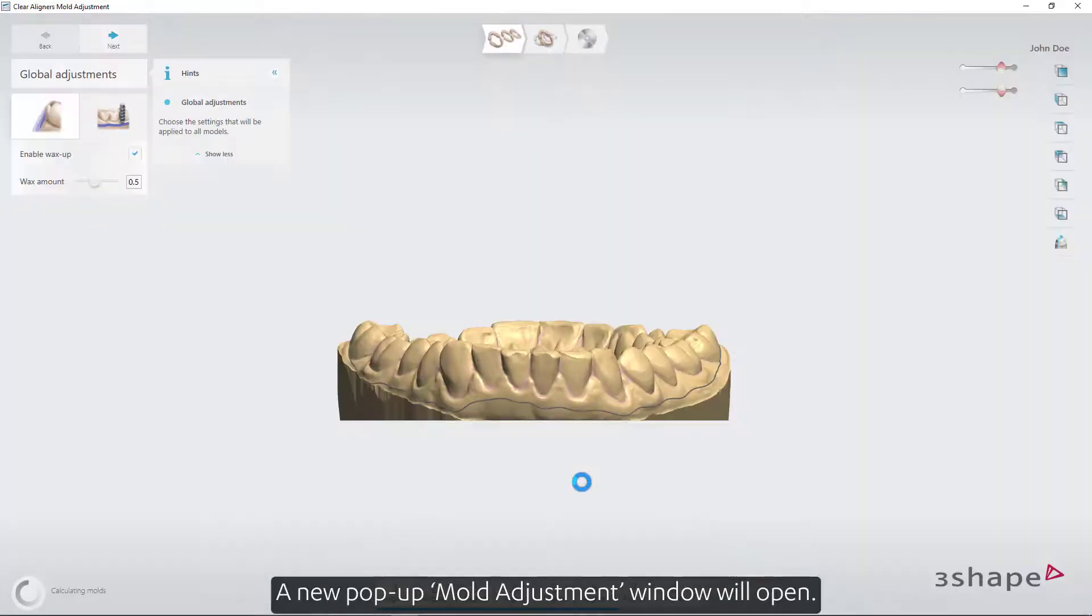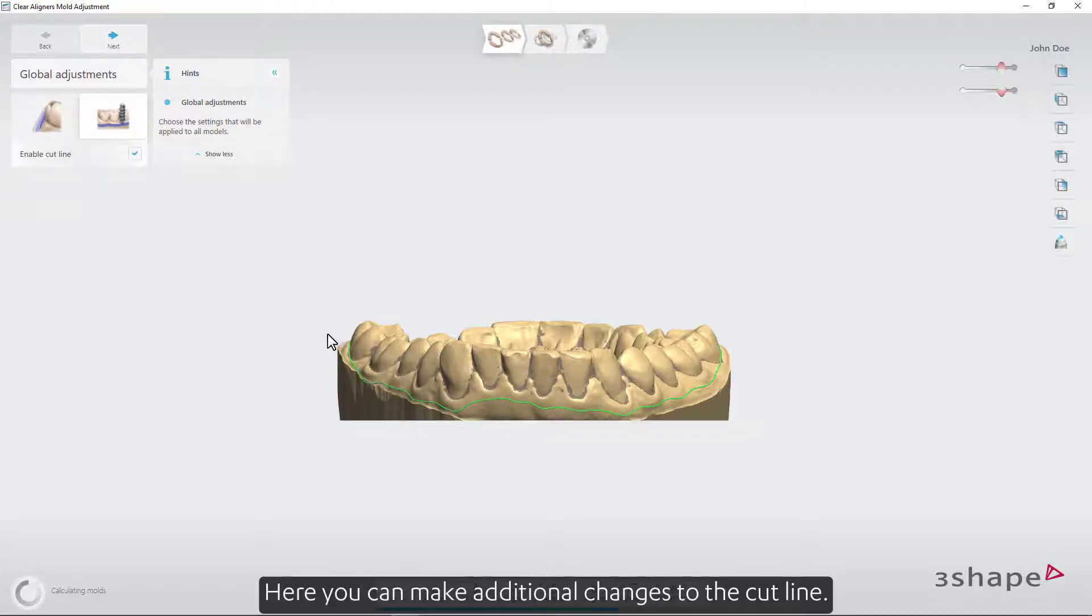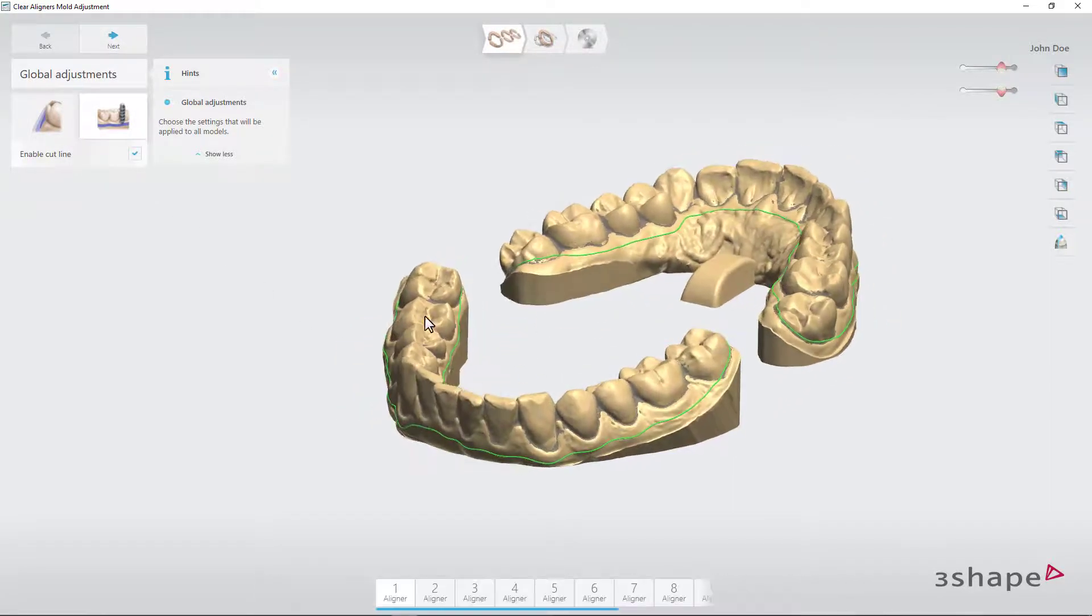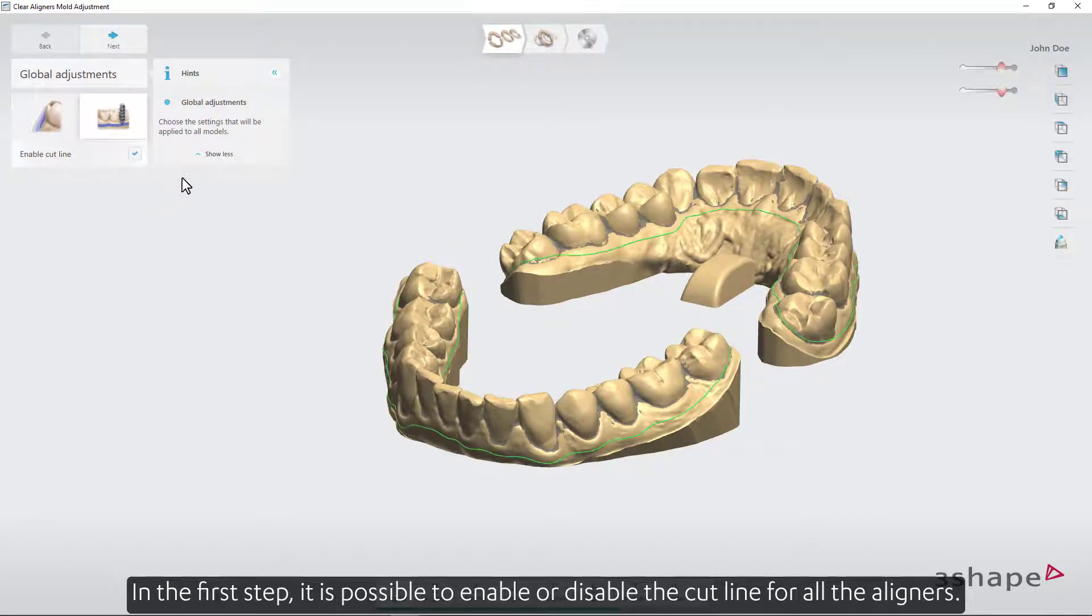A new pop-up mold adjustment window will open. Press Cut Line Editing. Here you can make additional changes to the cut line. In the first step, it's possible to enable or disable the cut line for all the aligners.